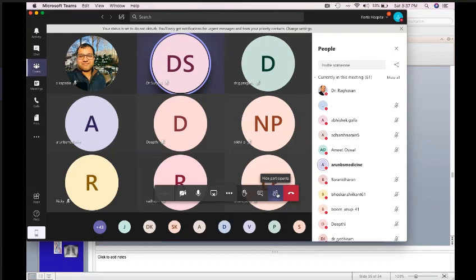Sir, the hepatoclavicular view is the same as the apical four-chamber view, which is LAO shallow. Apical four-chamber is used in echo, it's not used in angio. Yes, yes, it corresponds to that. Corresponds to shallow LAO cranial. Yes, okay.